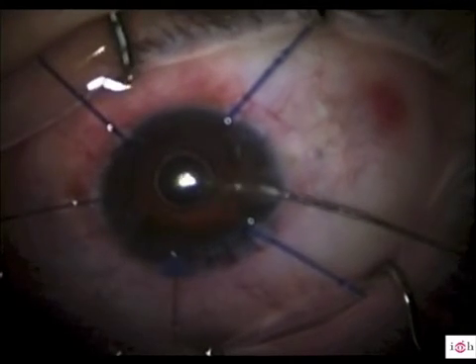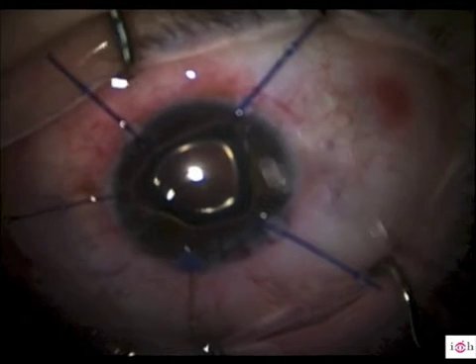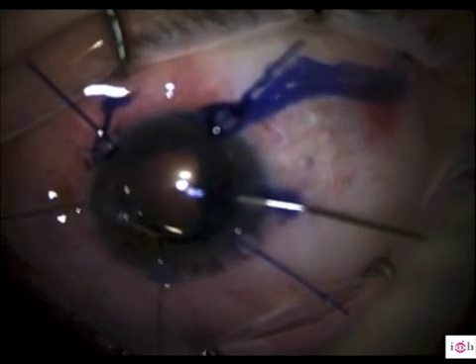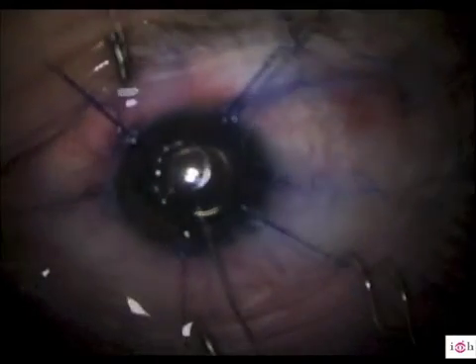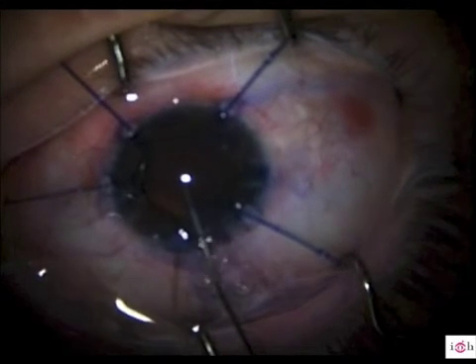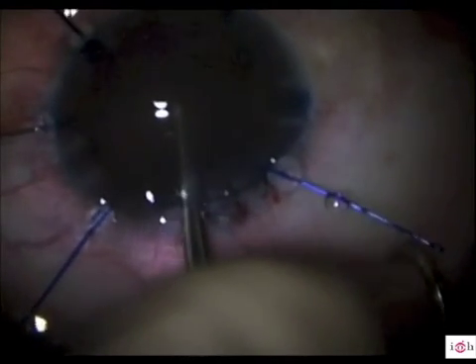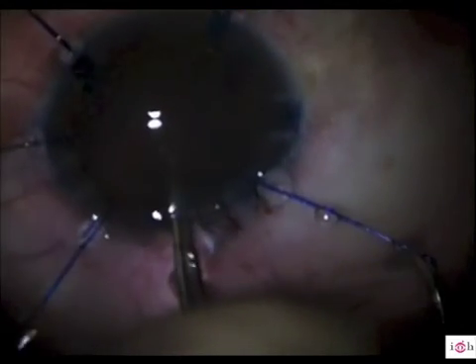Grieshaber disposable iris retractors were used to dilate the pupil. We washed the visco with irrigation, then we injected air and trypan blue for 1 minute to dye the anterior capsule. We injected viscoelastic and performed the capsulorhexis with forceps.